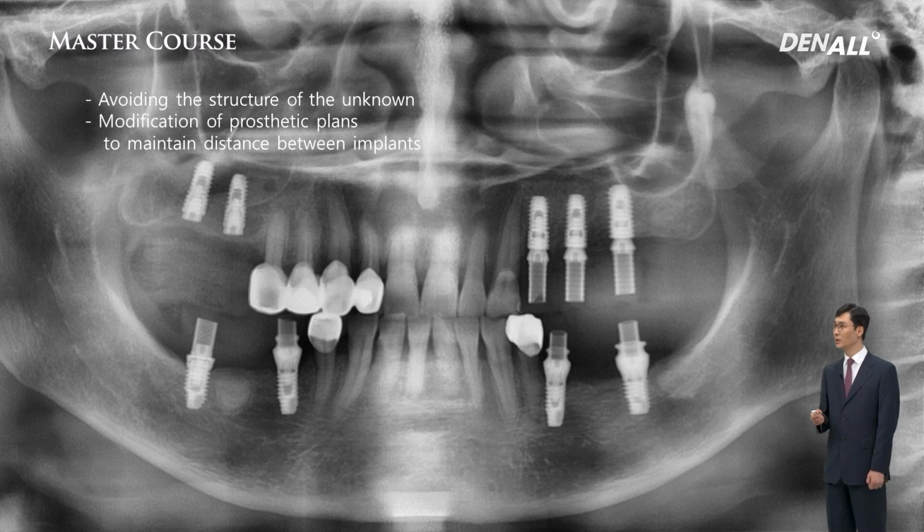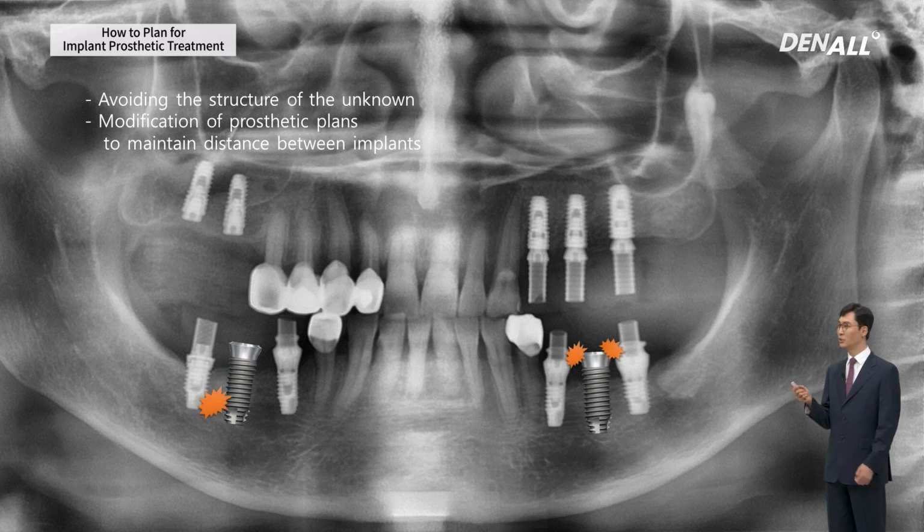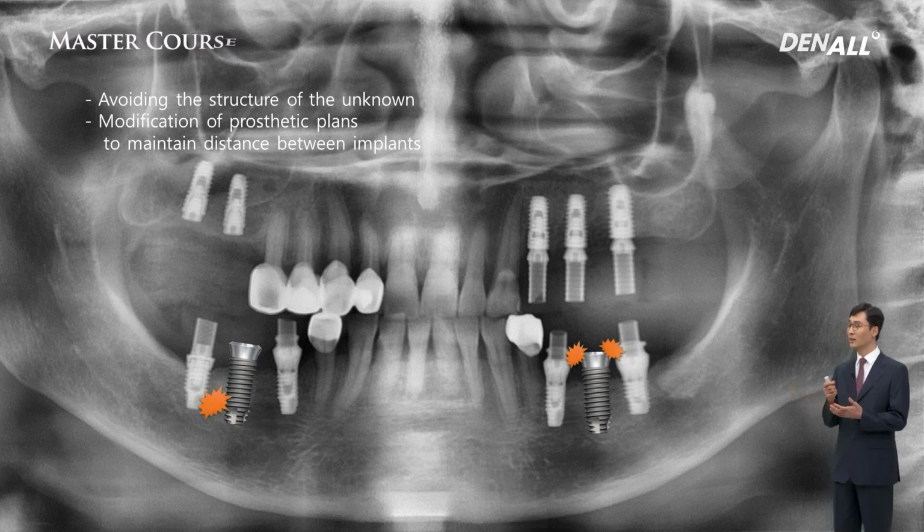This is during treatment. Implants have been placed in the upper right, upper left, lower left, and right. Because of the unknown sclerotic lesion, although originally I decided to place implants on top of the lesion, in the end I decided to avoid that.